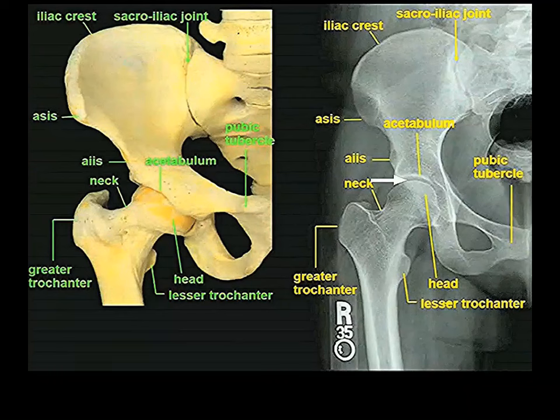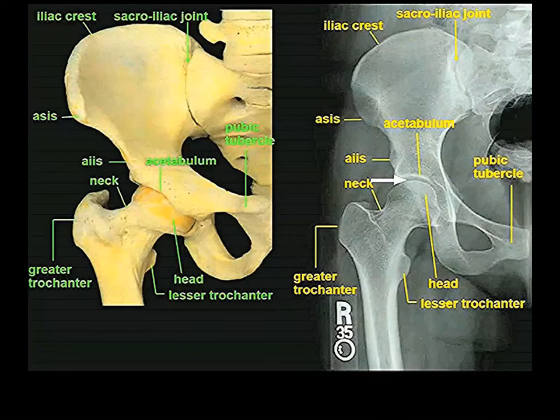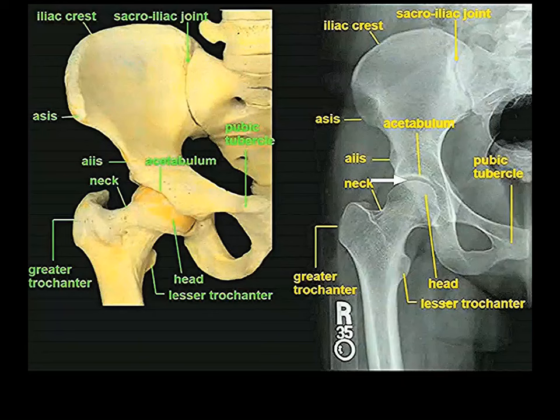Look at this radiolucent zone here. Why is it radiolucent? Because there's space there — not air, but cartilage. There's lots of cartilage on the head of your femur, and somewhat less but certainly present on the cup of your acetabulum. That separates these bones and gives you the impression that there's something like air or fluid in there, when in fact this is just cartilage.